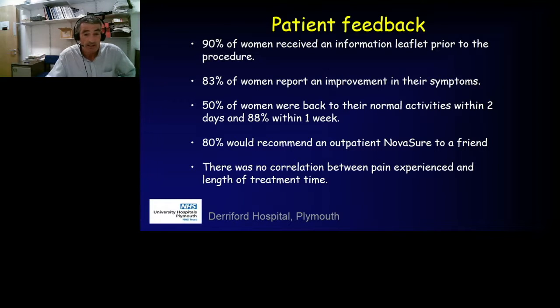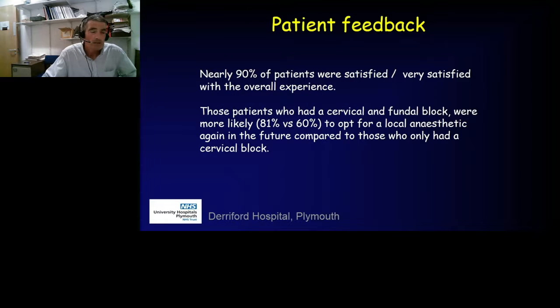80% would have recommended it in the outpatient setting to a friend or a relative, which was again very reassuring to us. And there was no correlation between pain experience and the length of treatment. So some patients end up with a minute and a half, slightly longer, and that didn't seem to increase the amount of discomfort that they were experiencing. So 90% of our patients were satisfied or very satisfied with the overall experience, which is really quite high for most medical procedures. So that should give people confidence that this is really quite the way forward.